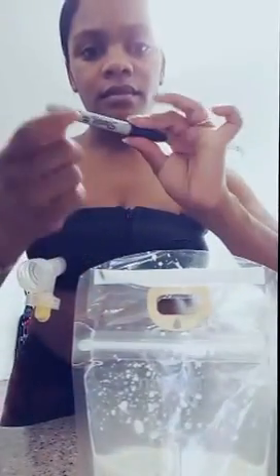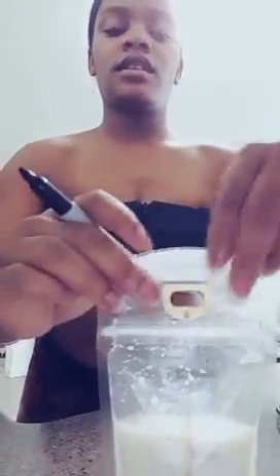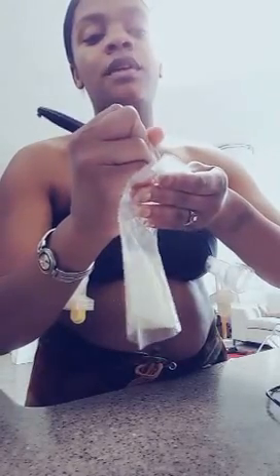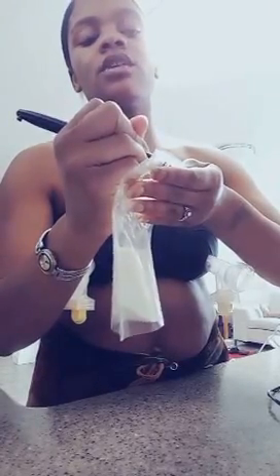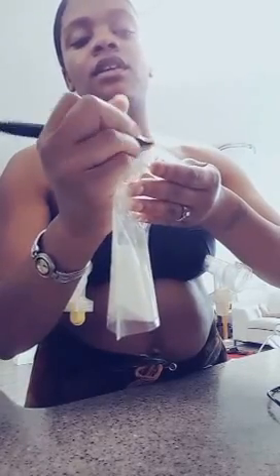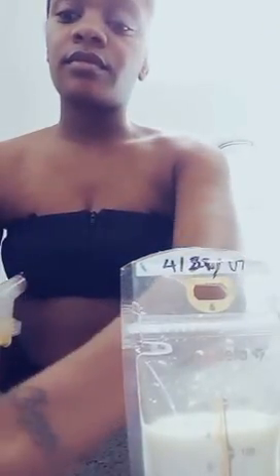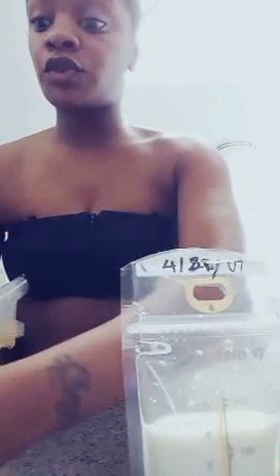So now, I keep a Sharpie with all of my breastfeeding things, and I write the date. So today is 4:30, I believe. Actually, I think it's 4:29. No, it's 4:30. You're going to write the date on your bag, and then store it. You can choose to store it in the refrigerator. You can choose to store it in the freezer. But there are rules to storing. So, let's go over the rules for storing.